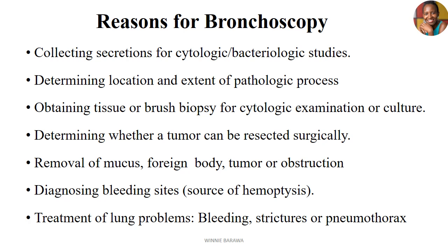And here are the reasons why a patient can be prescribed a bronchoscopy. One could be collection of secretions for cytological and bacteriological studies. You can also use bronchoscopy if you want to determine the location and extent of various pathological processes, that is, how far diseases have spread or how far the disease is progressing. And you can go in for bronchoscopy if you want to obtain tissue or brush biopsy for different examinations and culture.